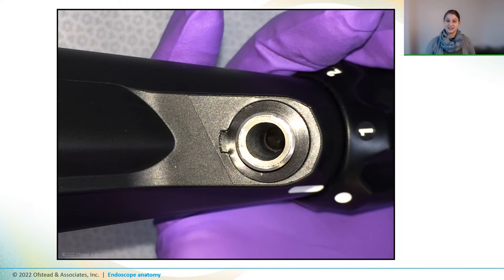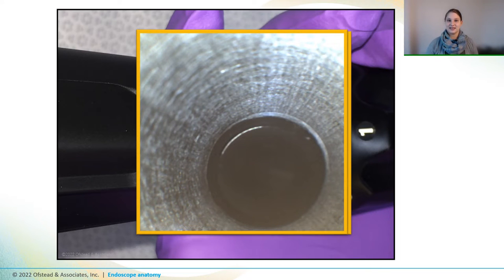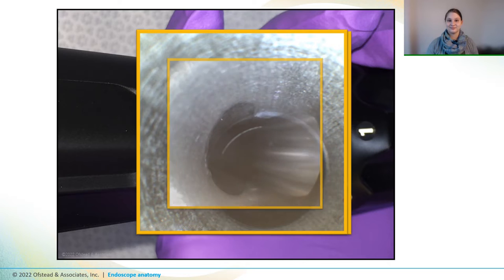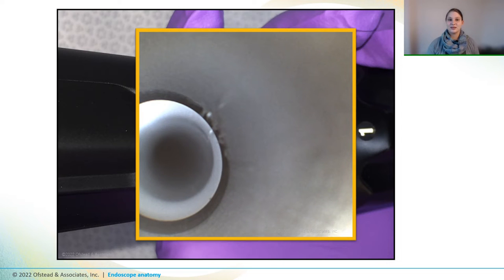So now let's take a look inside the main biopsy port and channel of a new colonoscope. We'll pick up our boroscope and take a photo right outside the rim of the biopsy port. This is what that port looks like as you begin to move inside. And this is the bifurcation, which is the area where the biopsy channel meets up with the other channels. And this is the beginning of the channel inside the insertion tube. Do you see that fuzzy stuff in the upper right-hand side? That's probably a little bit of manufacturing debris, which we commonly find inside new endoscopes, which reinforces the need to reprocess every new endoscope before it gets used on patients.